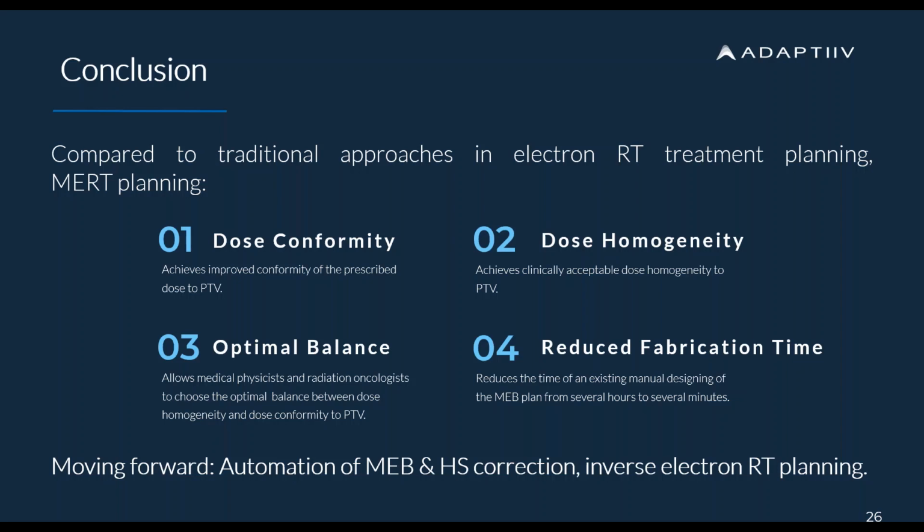So the excessive scattering of electrons from the peaks will most likely focus just beneath the valley and make a hotspot. So in our clinical user experience, that is the most likely case when your hotspots will be produced.